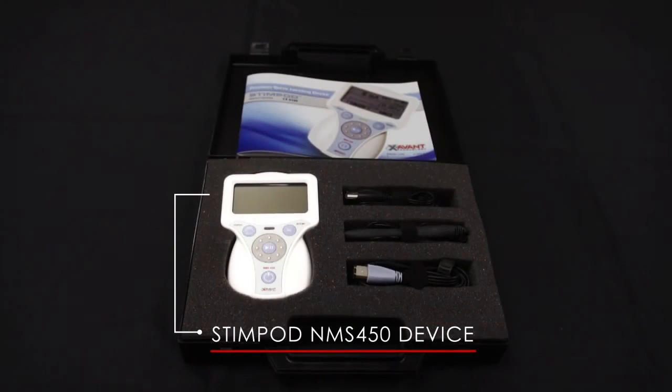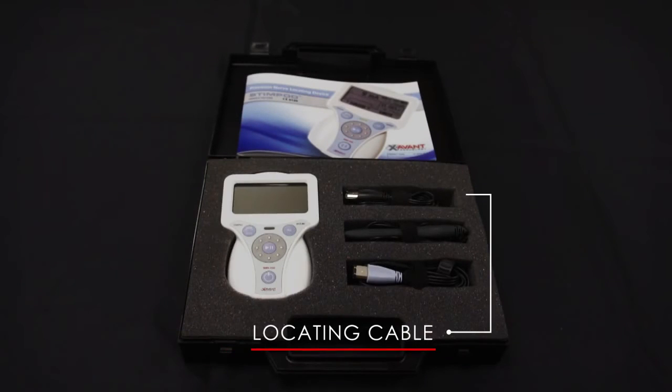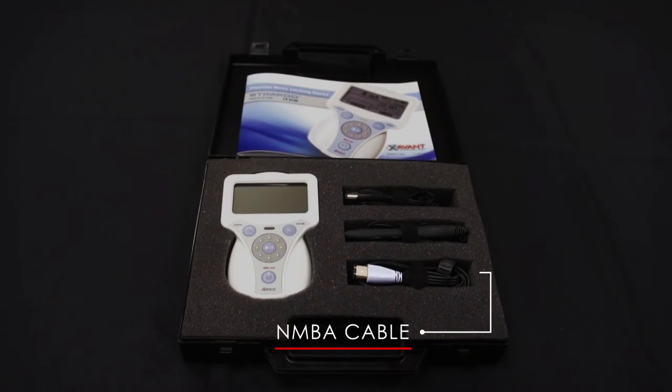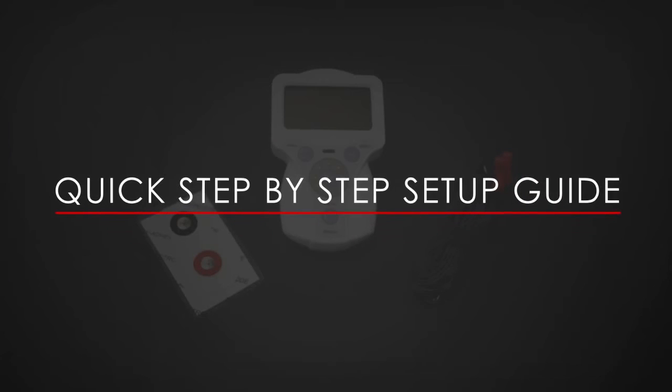The Stimpod NMS 450 kit consists of the following: the Stimpod NMS 450 device, locating cable, map locate cable, and NMBA cable.